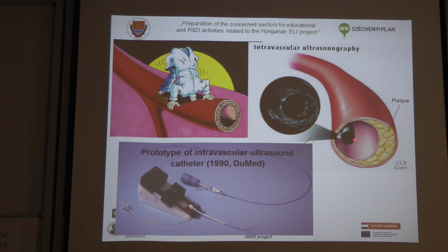So this catheter now is just less than 1 millimeter in diameter, and it doesn't really harm. It can, if we are not, let's say, delicate, not cautious enough. It still can harm the very fragile inside intimal layers of the coronary artery.